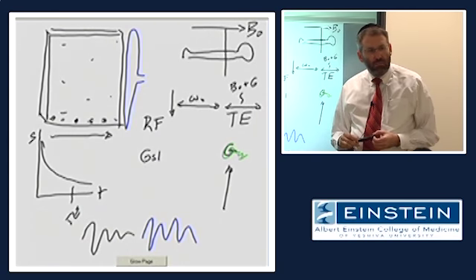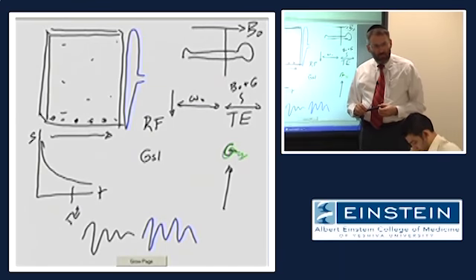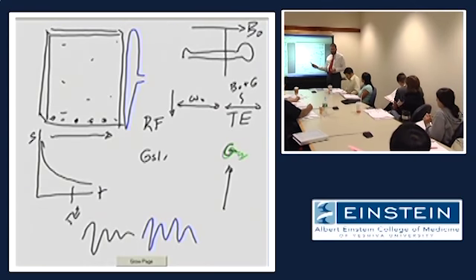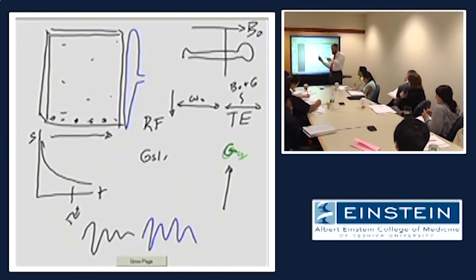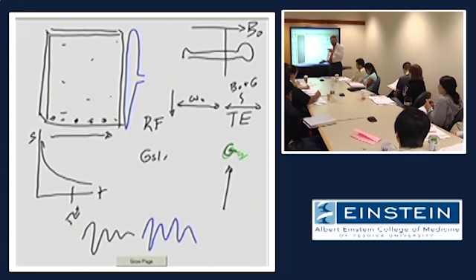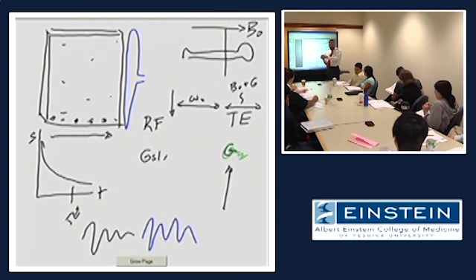And that is a separate gradient magnetic field? I mean, is this the same field that we applied in the beginning, we just do it again, or is it separate? Is it the same as the slice select gradient? No, it can't be. Because what I'm telling you is that we've selected this slice. To select this slice, we have to use a gradient perpendicular to the orientation of the slice. We now want to localize our spins in the plane of the slice, so we turn on one of the gradient magnetic fields that is orthogonal to that slice select gradient. Okay? Did that clarify what you were asking? Yeah. Okay. Any other questions at this point?